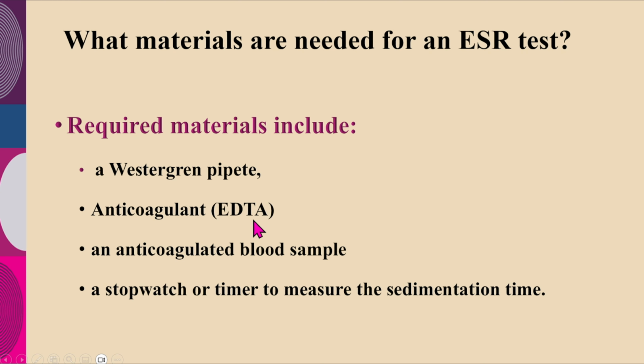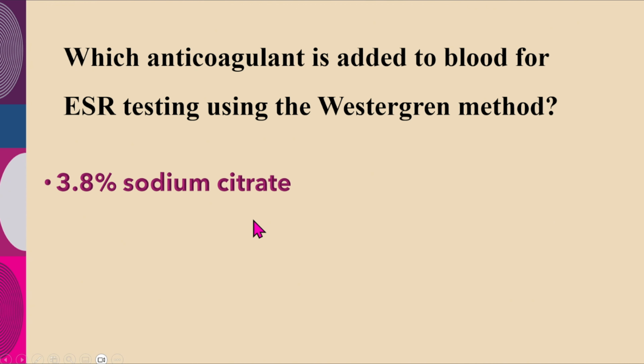Usually EDTA is an anticoagulant, but for this practical, particularly for this practical, we use 3.8% sodium citrate solution as anticoagulant. Okay.